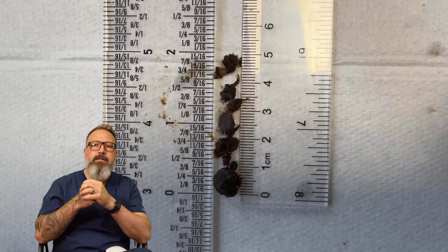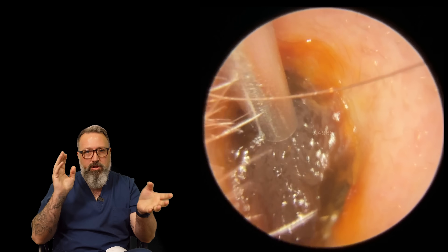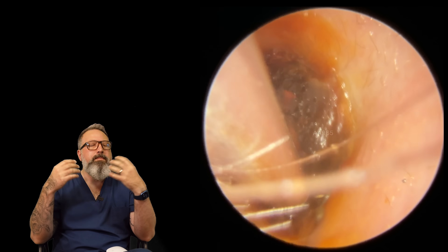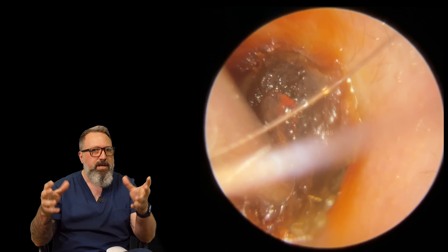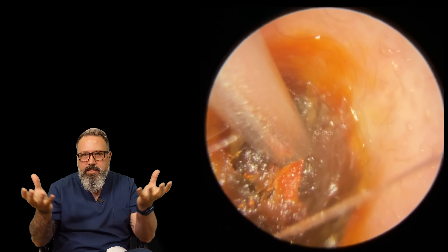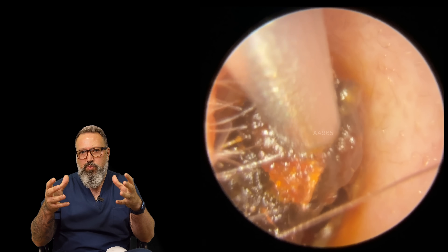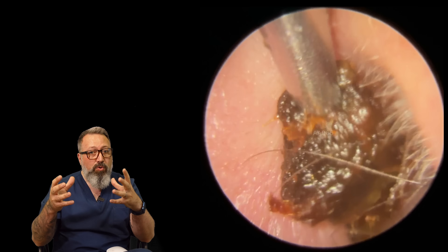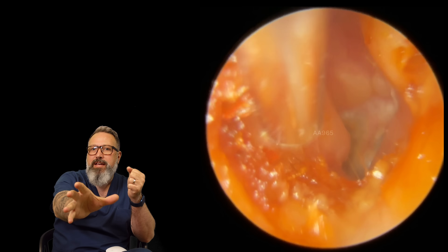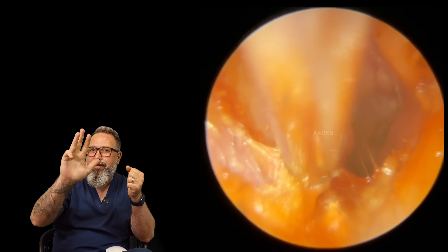Coming up next is surfer's ear. I hear the terms surfer's ear and swimmer's ear used interchangeably, but there's a differentiation now. Swimmer's ear is infections and things following water exposure. Surfer's ear is where you get exostoses - bony growths in the ear canal under the skin, forming lumps and bumps. It's common in swimmers, surfers, anyone exposed to water regularly - caused by the evaporation effect cooling the skin. Looking in here, you can see exostoses left, right, and two at the top - count them: four.